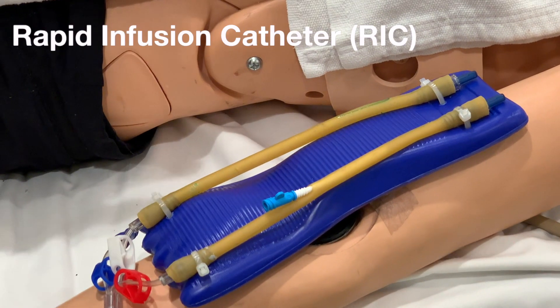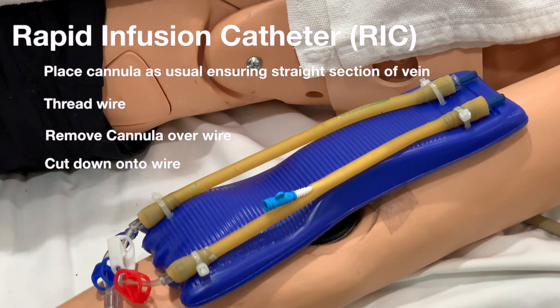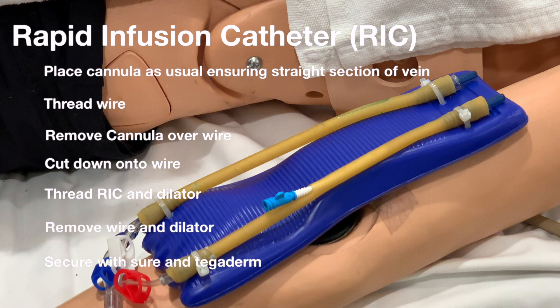RIC line insertion: place a cannula as usual, ensuring you have a straight section of vein about three and a half centimeters. Thread the wire, remove the cannula over the wire, cut down onto the wire, thread the RIC and dilator as one unit over the wire, then remove the wire and dilator as one unit. Secure with suture and place a tegaderm over the top.